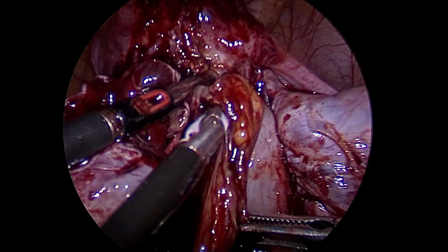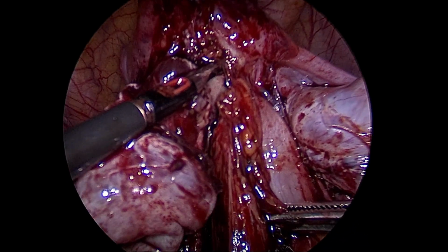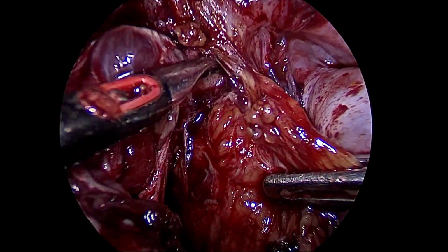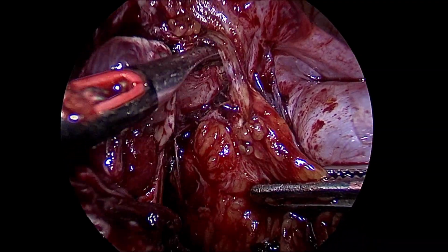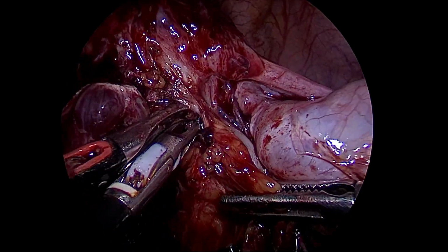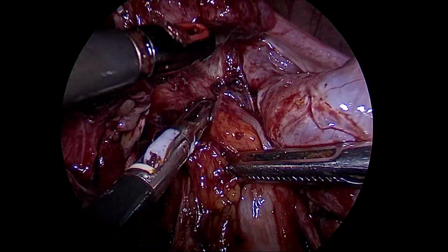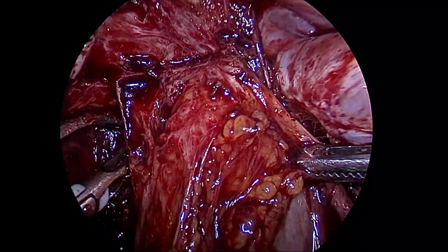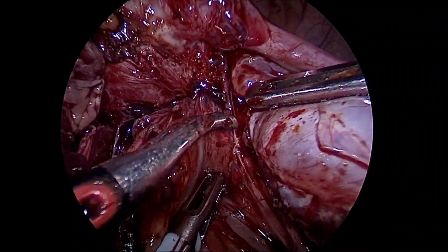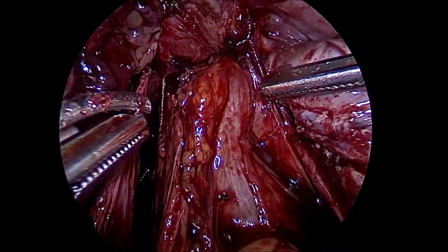The tube and the ovary are coming in the way because of their adhesions, so that is one thing that we need to keep in mind, that the tube and the ovary should not be damaged. Here these are the final adhesions which are noted. So we are keeping the bowel grasper between the adhesions and the shearers, thereby acting as a safety mechanism to prevent any untoward or unintended damage to the bowel.